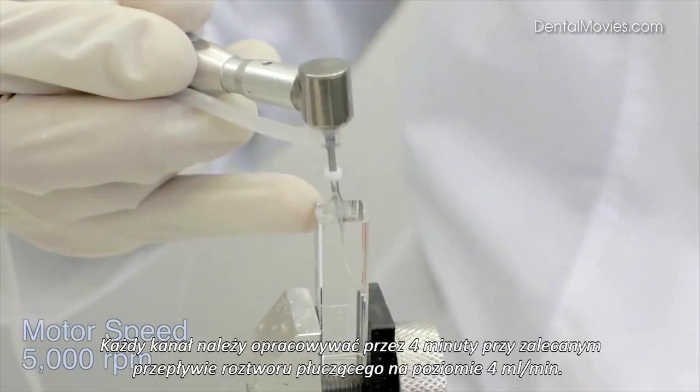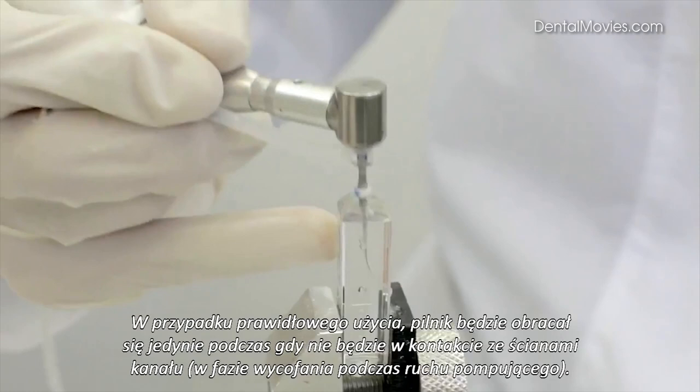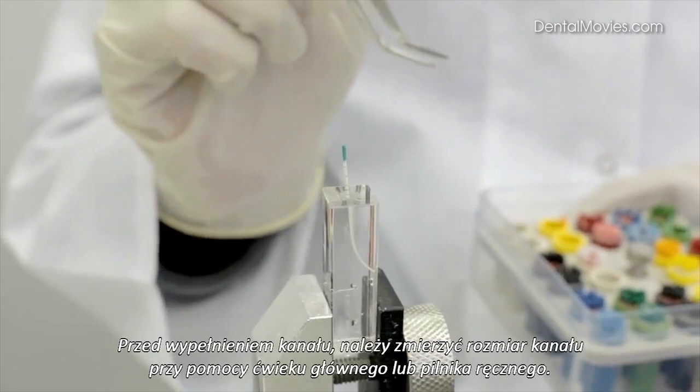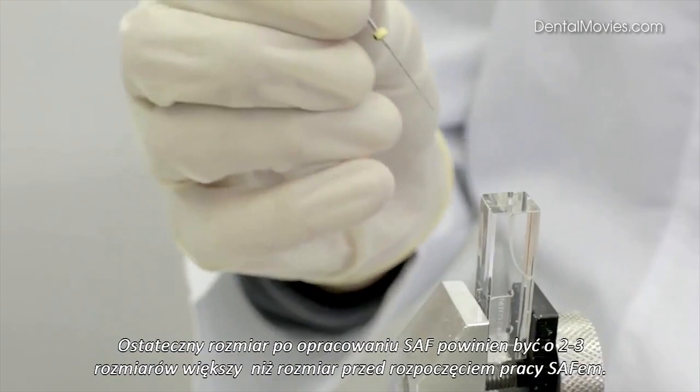Treat each canal using light pecking motions for 4 minutes with a recommended irrigant flow rate of 4 milliliters per minute. When used properly, the file is rotating to change its axial position only during the outbound stage of the pecking motion. Prior to obturation, gauge the prepared canal using gutta-percha master cones or NiTi hand files to determine final canal dimensions. Final canal dimensions are expected to be 2-3 ISO sizes larger than the initial apical size.